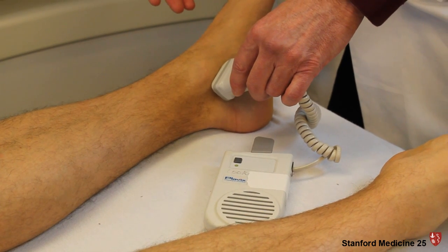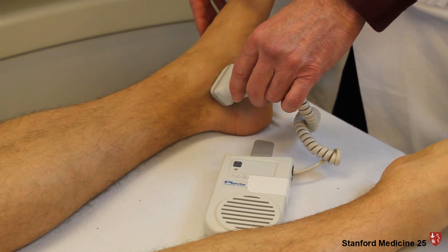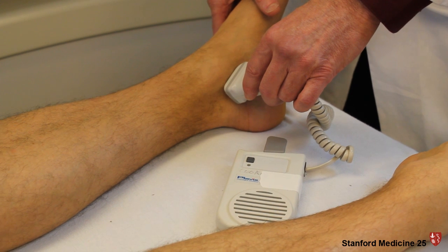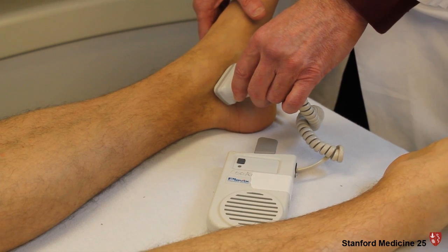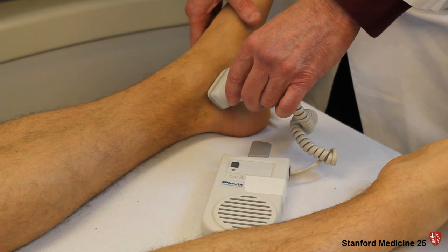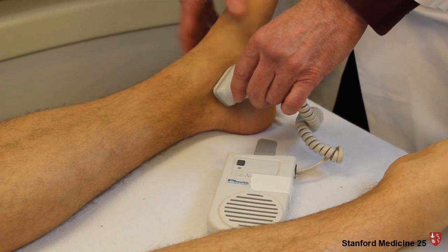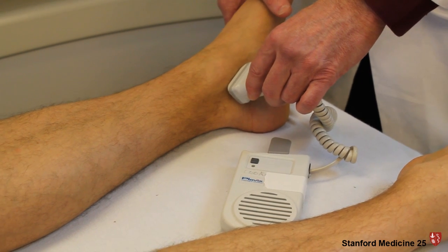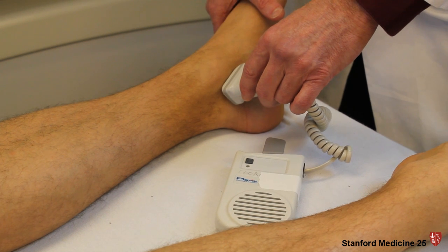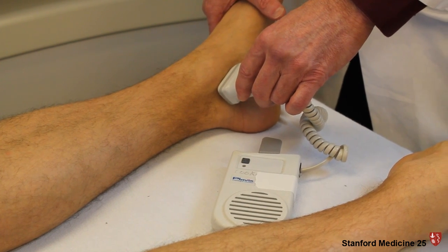In the foot, you basically listen over the posterior tibial. The posterior tibial vein is running adjacent to the posterior tibial artery, and you can hear the posterior tibial artery signal. You can't hear the venous signal unless you do an intervention, and the intervention is compression to increase venous return. So take a listen now to the arterial signal and watch what happens when I compress the foot.